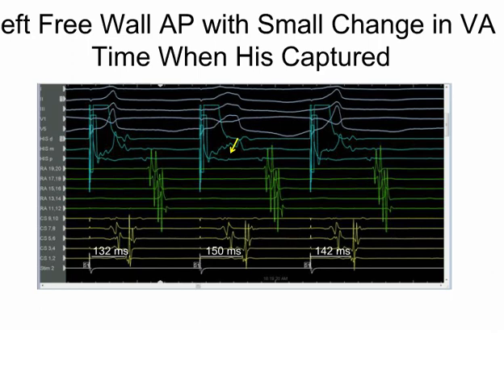So when you're pacing the right ventricle and you capture the His, you are going to have a slightly shorter route, but not the kind of change of 35 or more milliseconds. It's going to be in the sort of 15, 20 at the most, probably.